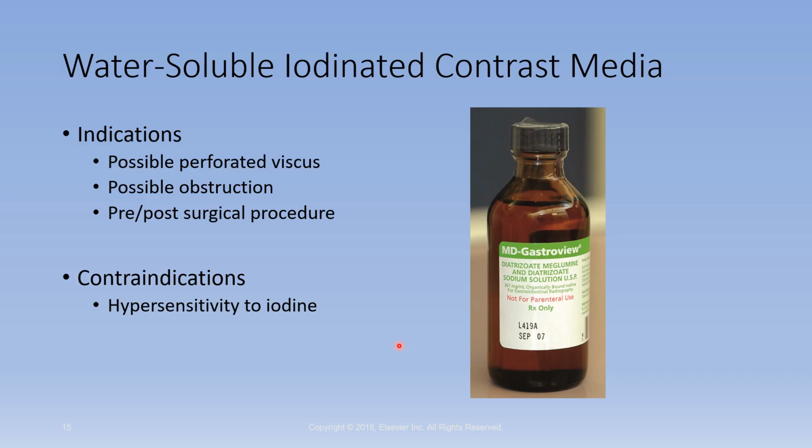So if I had one of those contraindications and I could not have the barium, I also could not have this. So they would likely have to do the exam a different way to figure out how to get my imaging done.